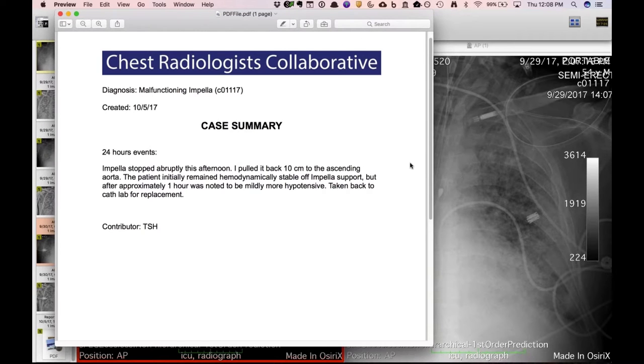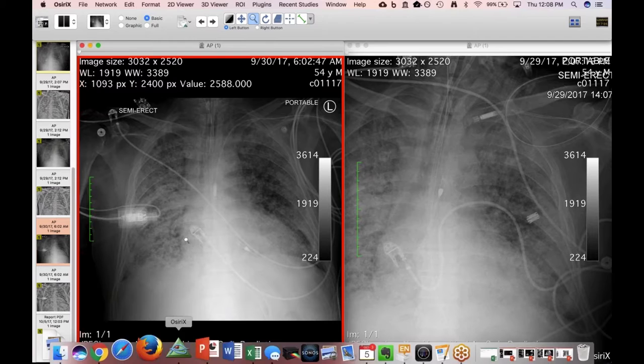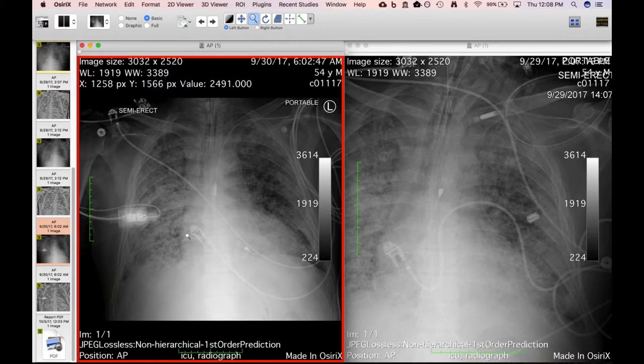intentional. Now, if it was failing, Travis, any harm in just leaving it where it was? I think they didn't comment on the rationale, but my guess is just since it's crossing the aortic valve, it may negatively affect native left ventricular function. I didn't get a chance to talk to the surgeon, but that would be my guess. But I don't know for sure. I don't know if anyone else has seen this before or encountered this problem, but that would be my assumption.